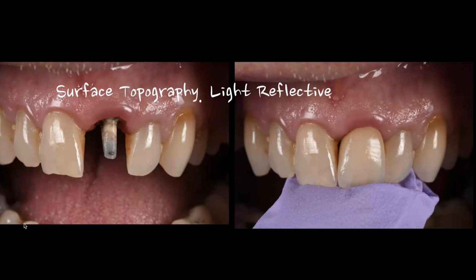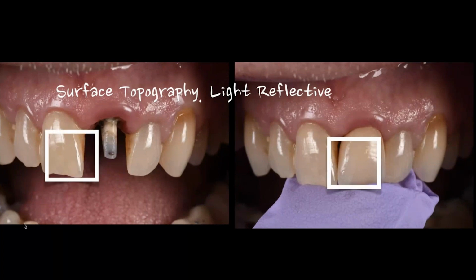We have a very small preparation here. And what I'd like you to notice on this tooth, it's an old tooth, I don't think it's one of my greatest matches, but here's what I wanted to point out. What makes this work or not work? The things that really make this work more: one, look at the mesial line angle on the tooth number 8, or the 1-1, and look at that beam of light that comes right up that mesial line angle. And look at my restoration to the right of your screen, and you should notice on my mesial line angle, the number 9 or the 2-1, it's pretty close.